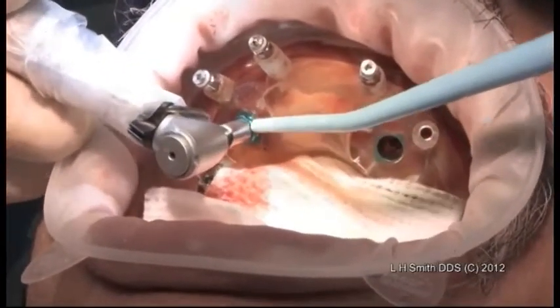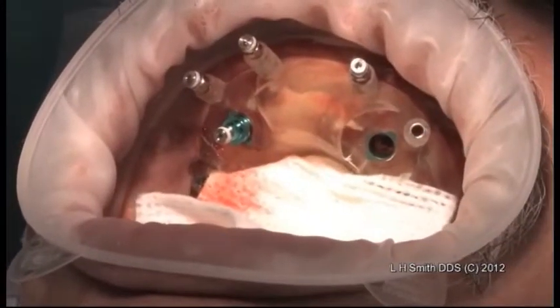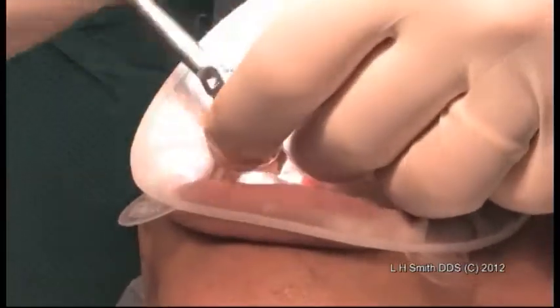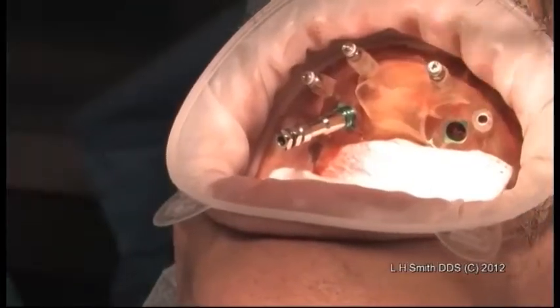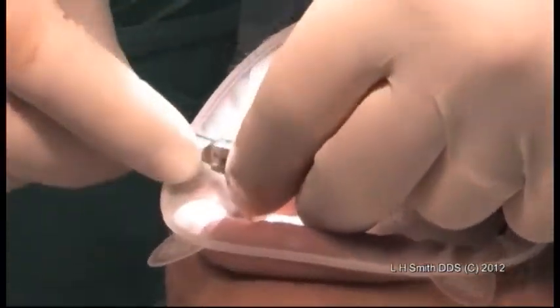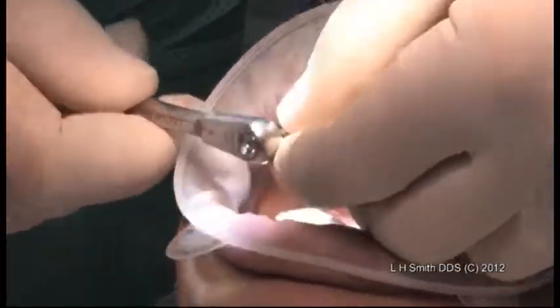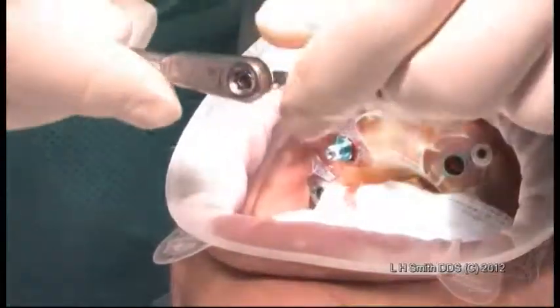It's within one to one and a half millimeters, so that means I'm going to go to the hand torquing. What I'm showing is we got within two millimeters of the seating of the implant. I'm going to back it up a couple of turns, and then we're going to come down and see how this goes. Now I'm just about there. This is breaking at 30 newton centimeters.